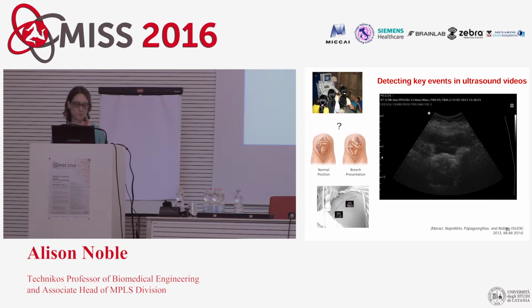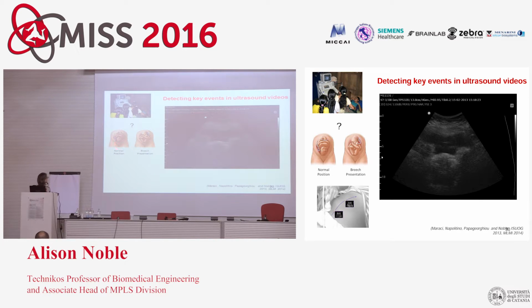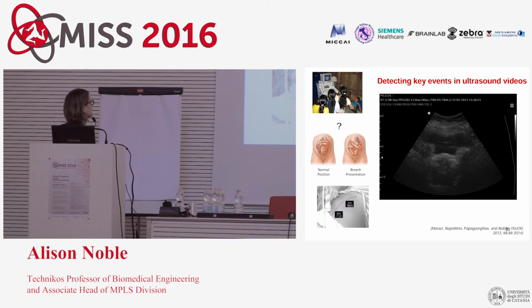For us, that's quite a simple problem, because if you could scan over in this direction, take scans, then it translates to the problem of being able to find the region in the video where you found a head. Is the head at the beginning of the video, or at the end? The key thing here is, rather than use the traditional way of doing ultrasound, where an expert moves around the probe with some clever movement and then interprets what they see, we're saying let's not do that. Let's move to a very simple protocol that anybody can be trained to do. You just have a certain time, you go from here to here, you go in a line. What can we then interpret from scans of that kind?